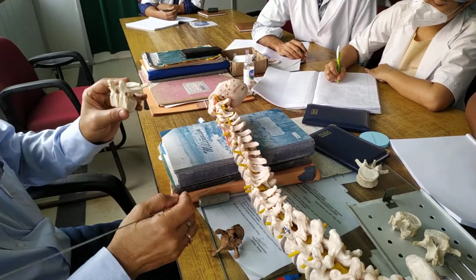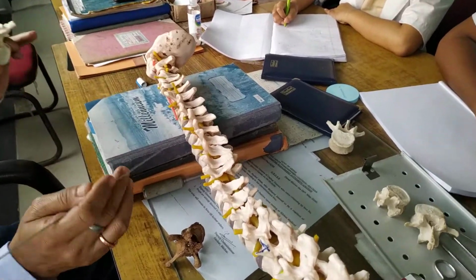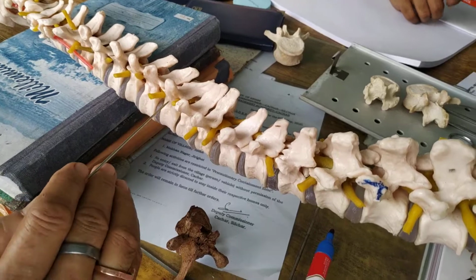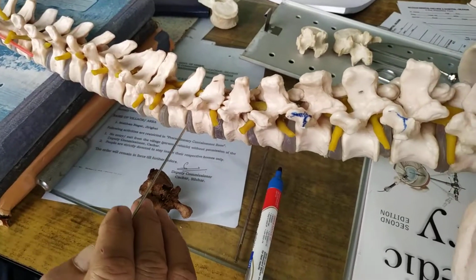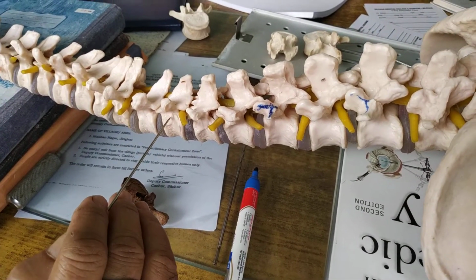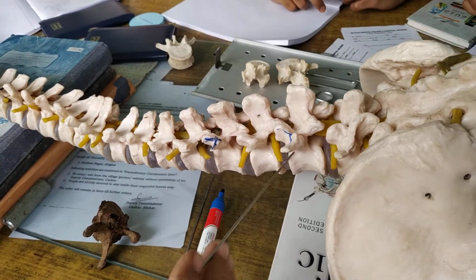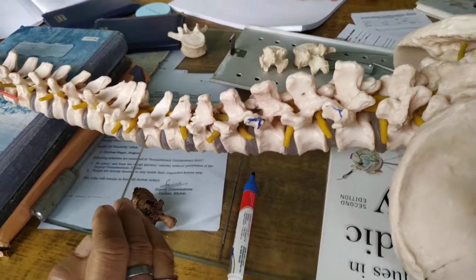But if you look at this pedicle attachment here, you will find it is directed towards the caudal side. But if you come to the lumbar area, you will find it is almost perpendicular. So this is the important thing.